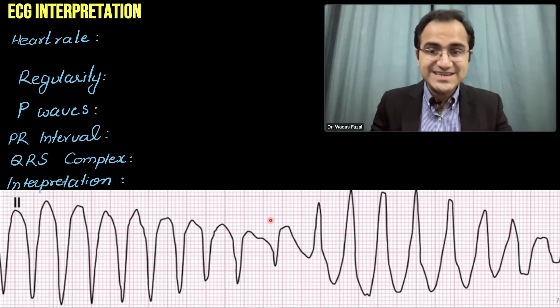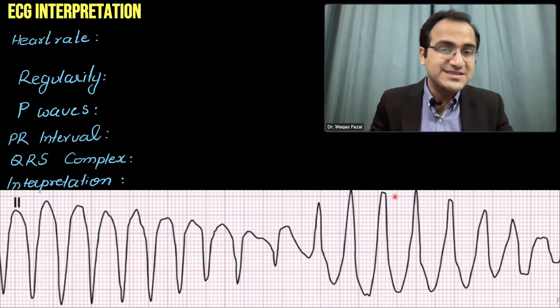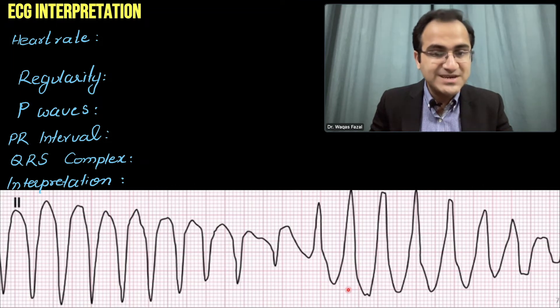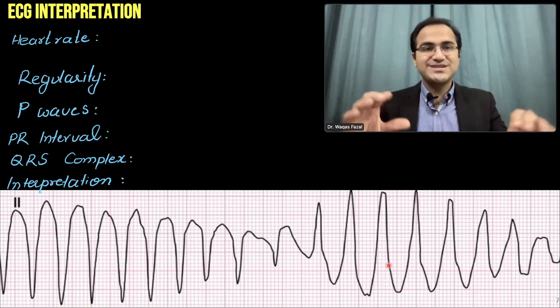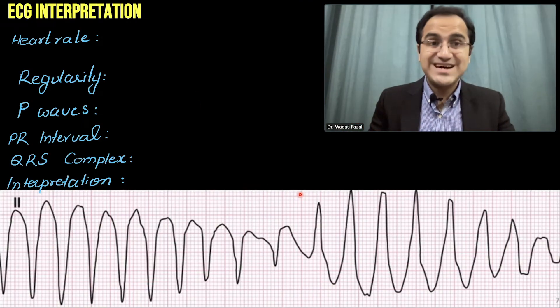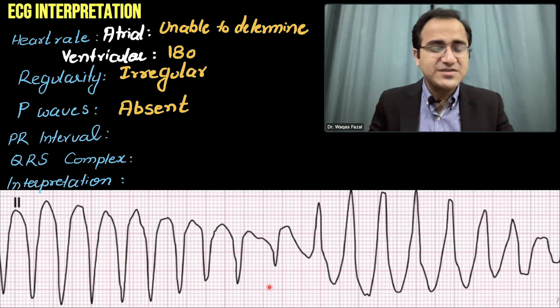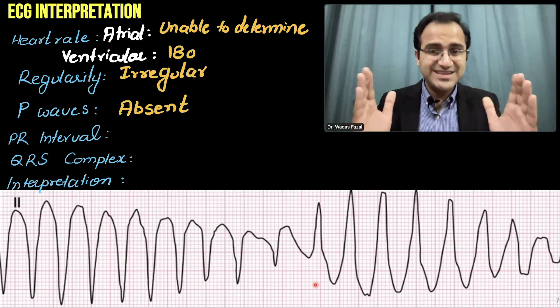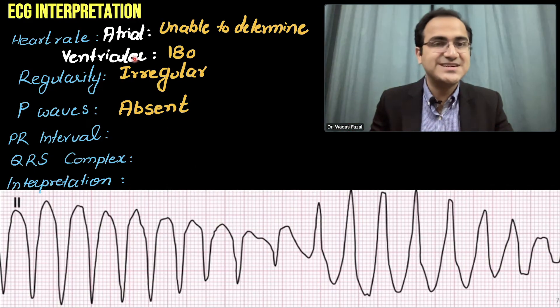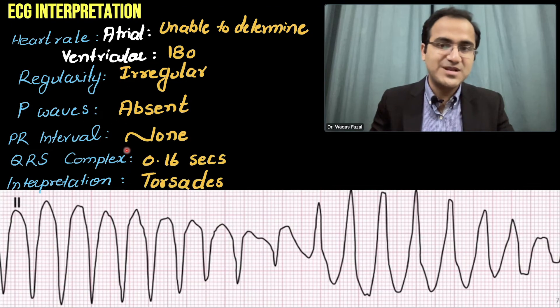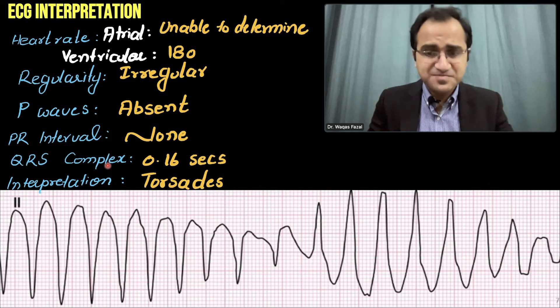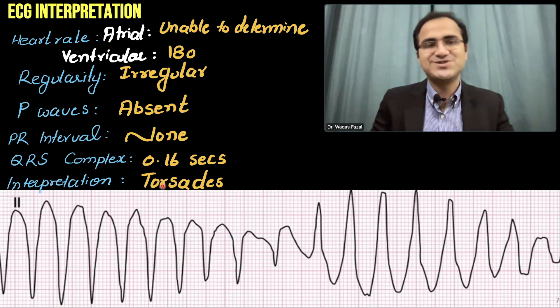Looking at this second ECG, these are the pointed ends and these are the rounded ends — confirming the twisting of the points, torsades de pointes. The atrial rate is unable to be determined. Using the same six-second method, the ventricular rate is 180 beats per minute. Regularity is irregular, P waves are absent, there is no PR interval, QRS complex is wide, and the interpretation is torsades.